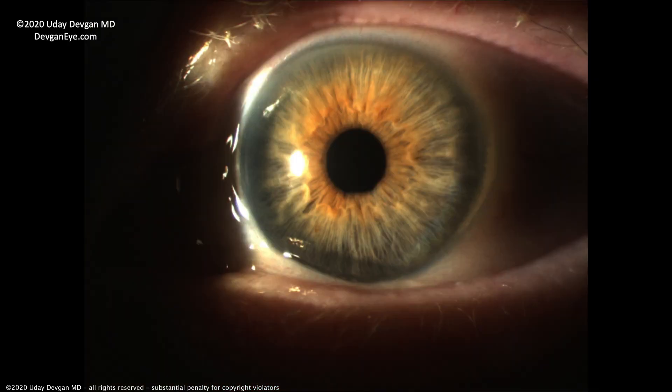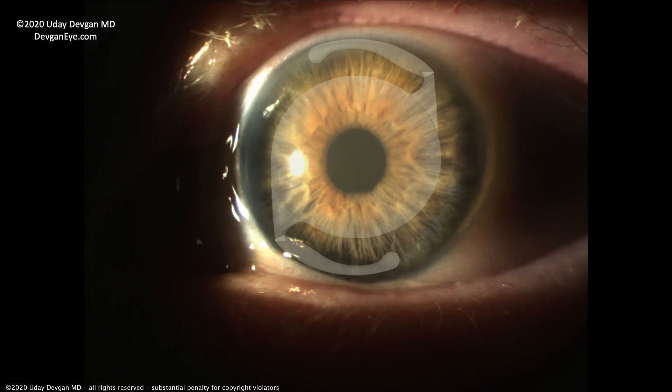This is a patient right after cataract surgery. The eye looks totally normal. If you look at that central pupil, it's nice and clear — jet black as it should be. There is a man-made lens implant in this eye, but you don't see it. It's behind the blue, green, or brown iris. This lens is permanent in the eye behind the iris — it never comes out. Even if you rub your eye, it doesn't come out.